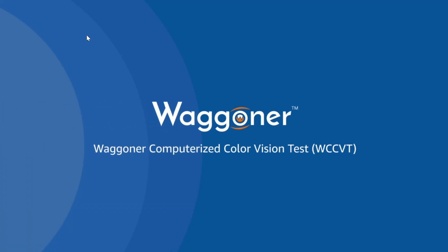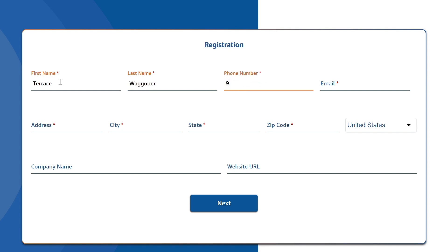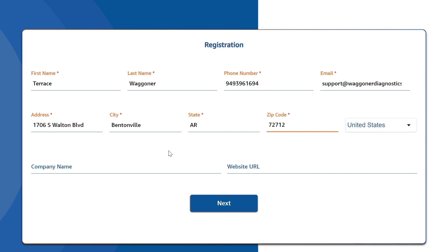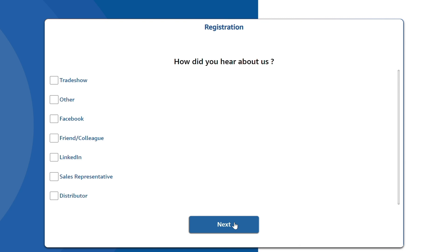You have installed the Wagoner Color Vision Test Suite. Complete the registration page. Next, select your preferred testing protocol. The default options are Wagoner Diagnostics Suggested Protocol. If you change your mind, you can always change these in the Settings tab of the app.